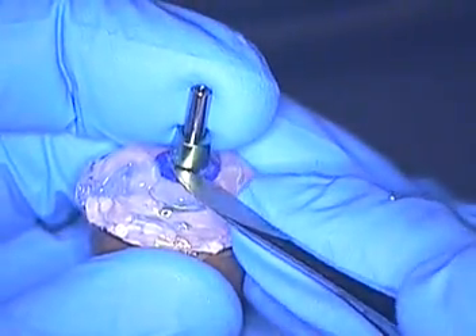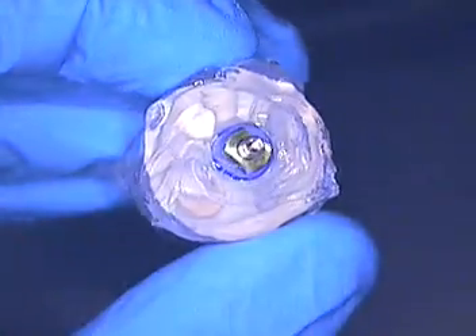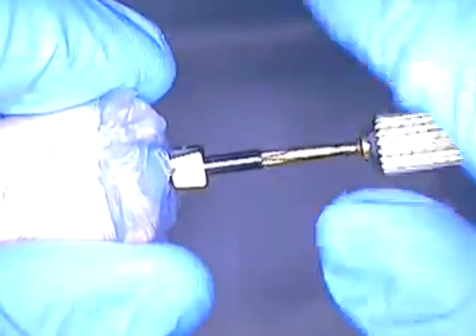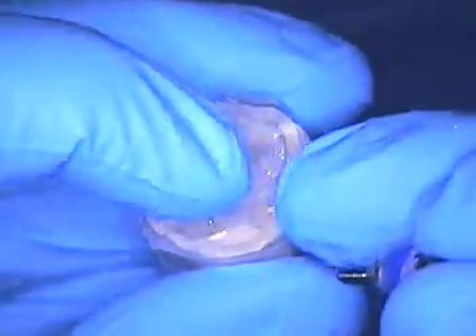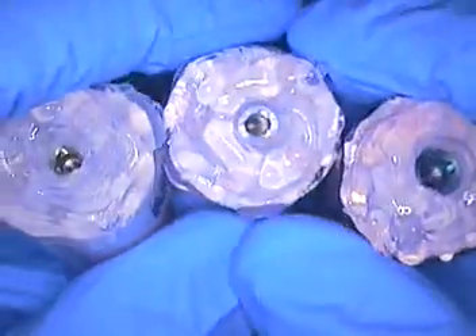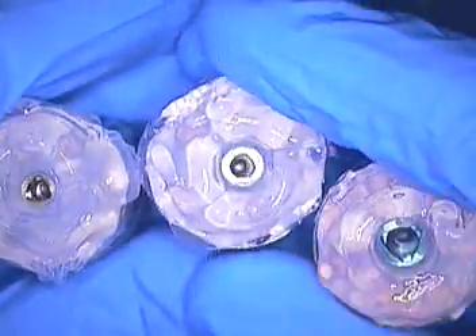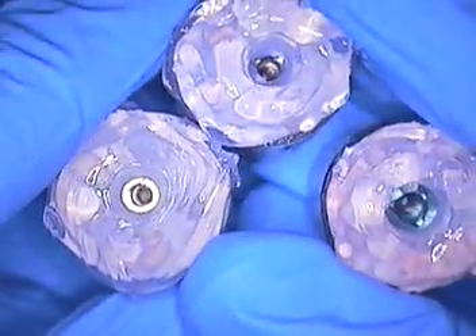Let me attach this — I'll lift this one up. This is the green, and there's the imprint of the green. It came out beautiful. I've got that for future cases as well and also for the lab. And this last one here is yellow — let's just remove that one. You don't need to make a lot of these, just one for each color code. So there are the three. Now I can put another impression coping in there, or a peak abutment, just to copy the tissue. I can also put the healing abutments in here and add composite to the periphery so that it will match the scanned impression. Nothing better than keeping the soft tissue mimicking identical to what's going in.